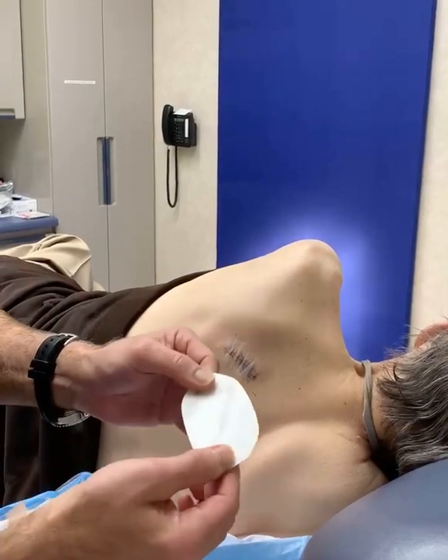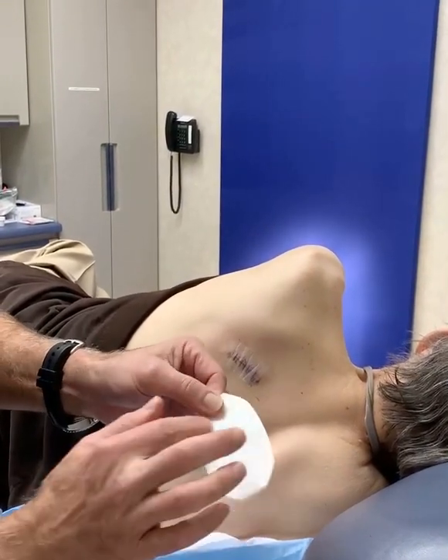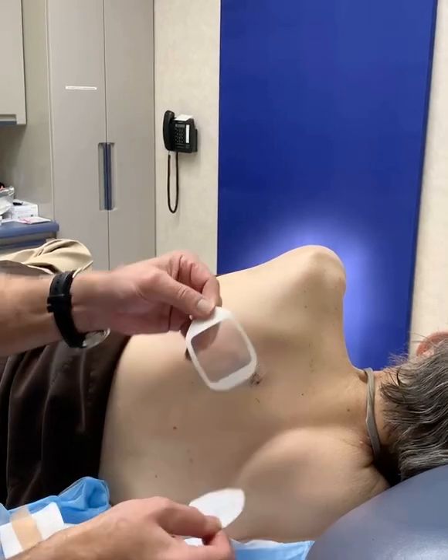The written, the white tab, and then a clear plastic. You'll peel off the written portion.